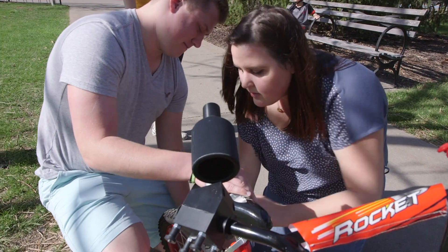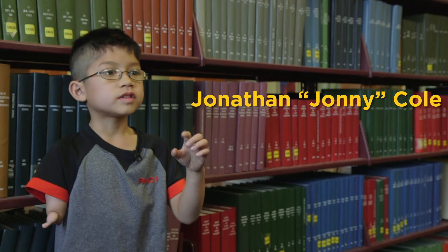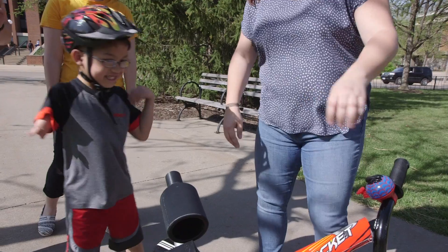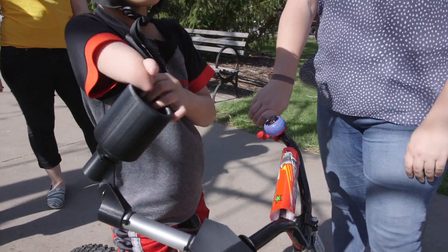It's been a process — a lot of tinkering with dimensions, with angles, and different kinds of joints. There's a part where I put my hand, and then there's this big cube that connects to my bike.